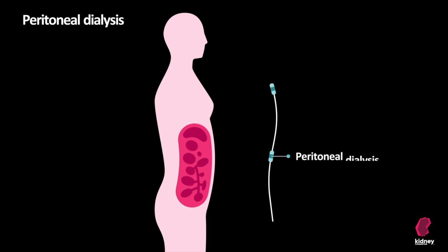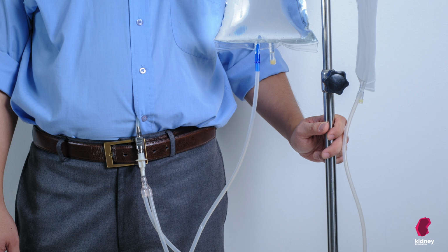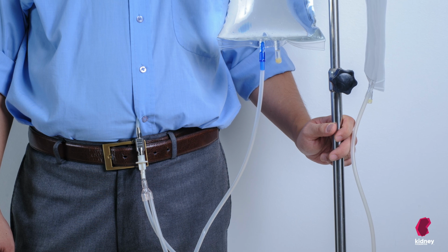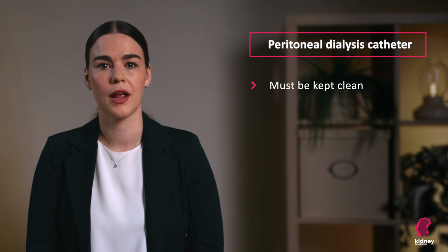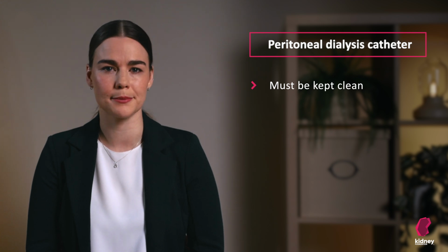Now let's talk about the peritoneal dialysis catheter, which connects the inside and the outside of your abdomen. About 15 to 20 centimeters of the catheter is visible outside your abdomen. When wearing regular clothes over the catheter, it is usually not noticeable. Your catheter can stay in your abdomen as long as you need it. It is very important you keep this catheter clean to prevent an infection. Your healthcare team will teach you how to use this catheter and keep it clean.